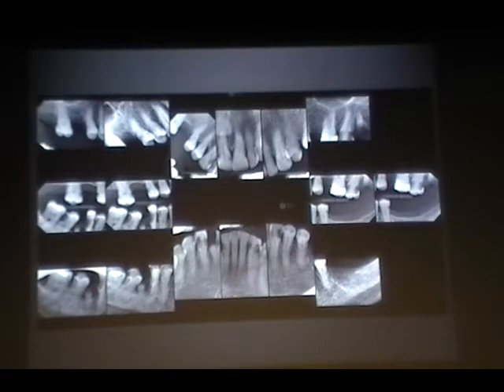And the open contact is, there's very little open contact, I don't know if that's considered. So let me ask you this question. In that particular view, what teeth are you supposed to capture? Lateral? Do you say lateral incisor? She's also looking like me, like this.